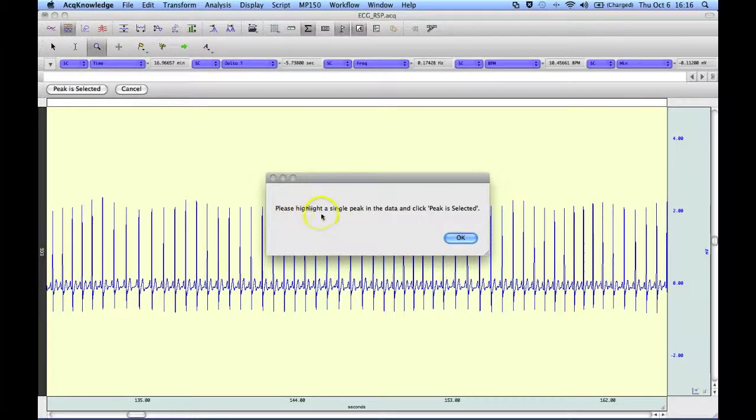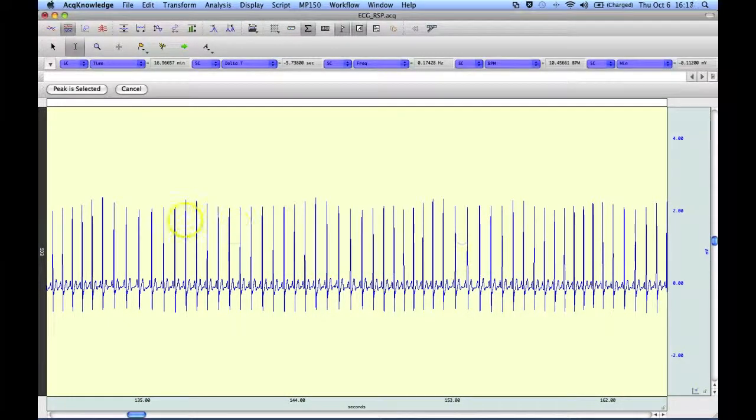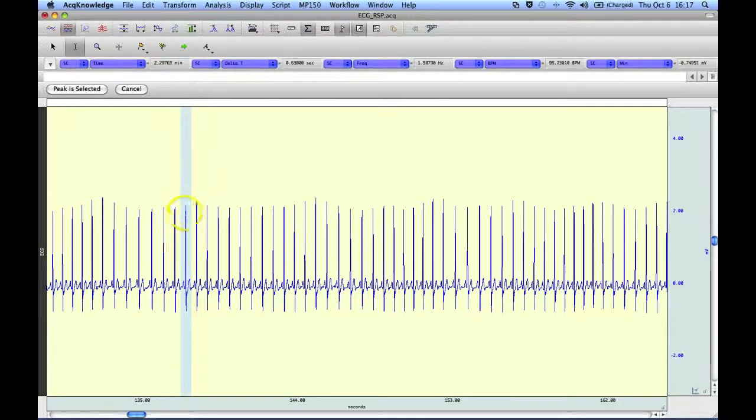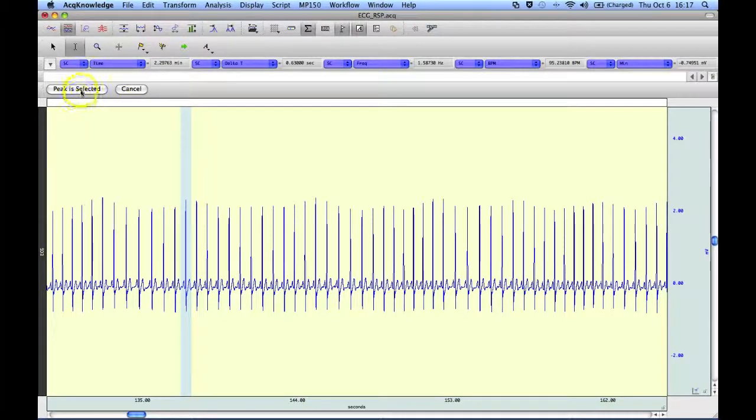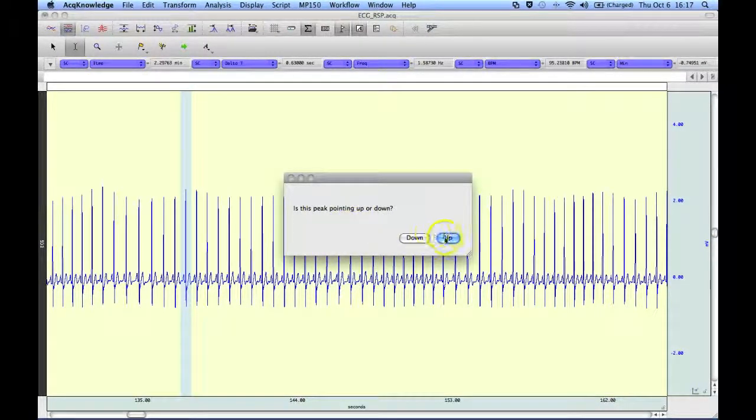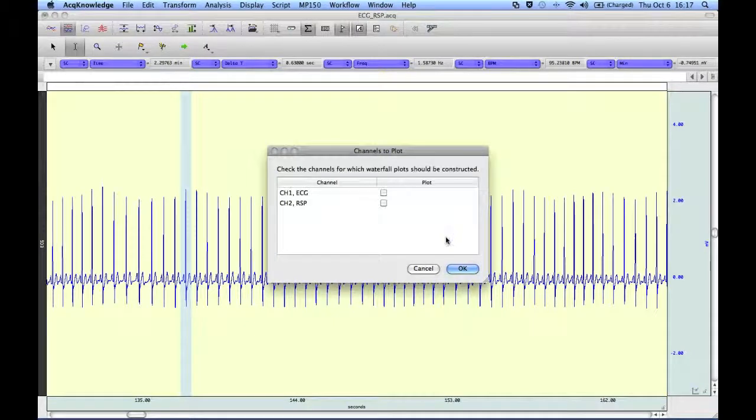So we're asked to highlight a single peak in the data. I'm going to highlight one single ECG complex, my peak is selected, and the peak is going up.